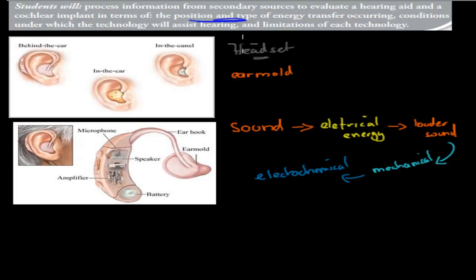And with the hearing aid, so the first part is a hearing aid. All we have is a headset. Remember, the headset had the microphone and the amplifier and the speaker in it.